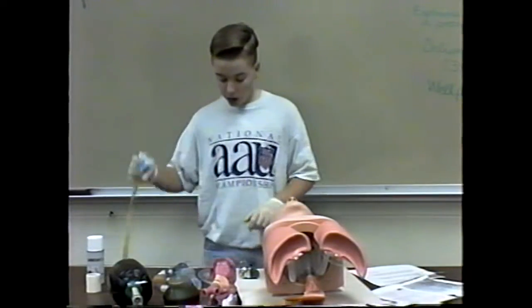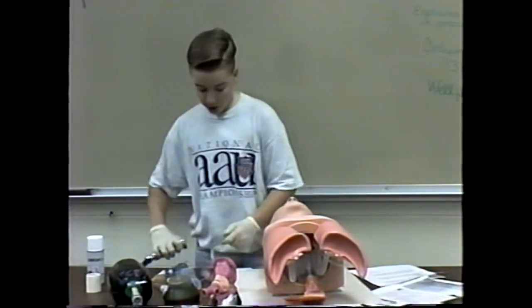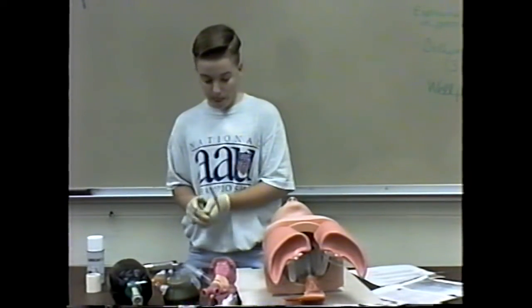The commercial tube holding device is used on the oral endotracheal intubation, which is down the throat.